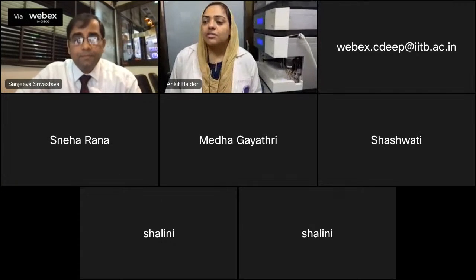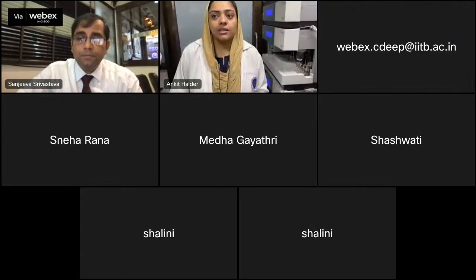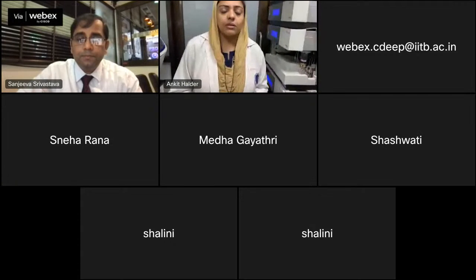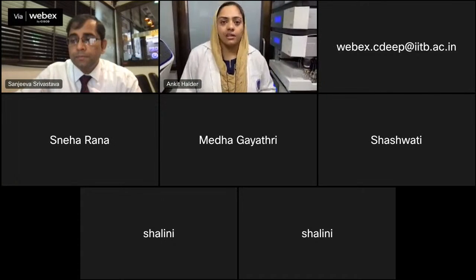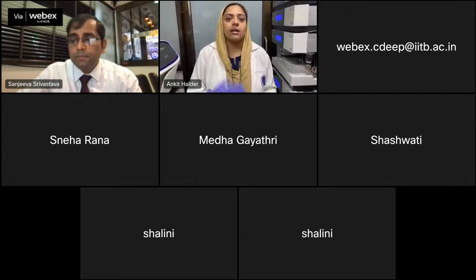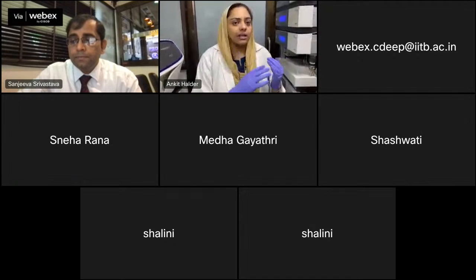Hello everyone. So now, as he just talked to you about targeted proteomics, in which two basic techniques are majorly used, one is MRM and the other is PRM. So he has already explained its basic principle. Just to brief about it, in targeted proteomics we already have the target list of proteins or biomolecules such as metabolites, and we aim to monitor only our target list of proteins.